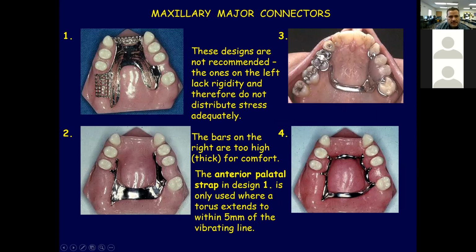You can see in the maxilla, we have space. Some people don't like this one. Why do you think we don't like this? Because we have space. Why do we use this one? When you have a very small one, there might be movement. There might be torque, and every time there is movement of the partial denture, the movement will transfer to the remaining teeth and will damage the remaining teeth.